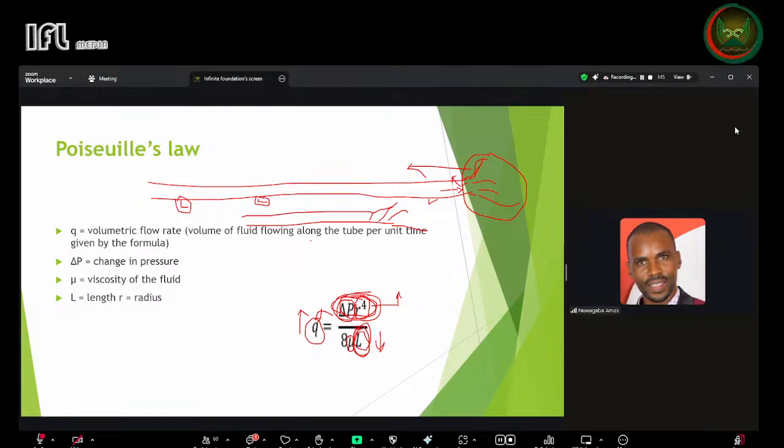So at the placental side, if you do not have placental scarring, it is like free movement, both across and from the other side and to the placenta as well. So that is the reason why we see that change in the resistance, and it is usually lower at the placenta side because of where the blood is coming from the fetus.